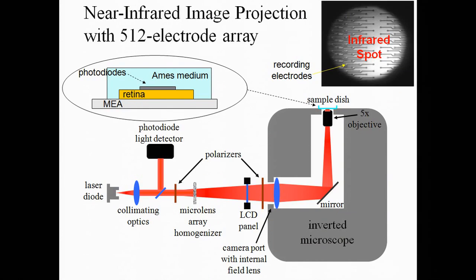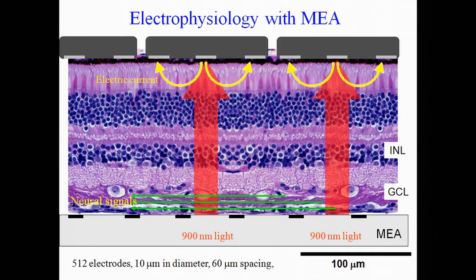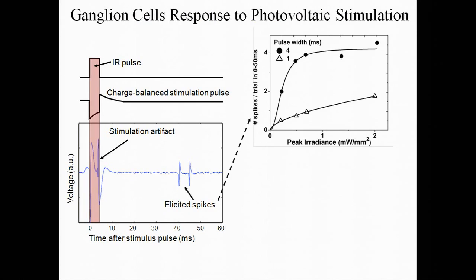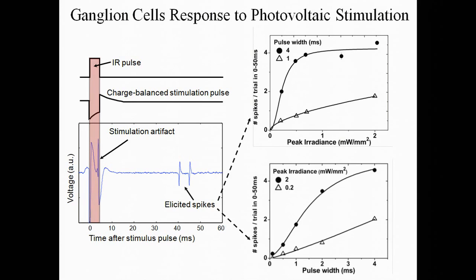To check what the retina does in response to stimulation, we use a multi-electrode array. It's an array of 500 little electrodes that read signals from hundreds of ganglion cells simultaneously. The image is projected onto a subretinal array through the retina, exactly like it happens in the eye. So the light goes through the retina, the photovoltaic array converts it into current, the cells are stimulated, signals are transmitted to ganglion cells, and we read them out with this multi-electrode array. What you see in response to a pulse of light is a current generated in each pixel. We pick it up as an artifact of stimulation, and then you see the retinal response, which is shown here in spikes. The number of spikes increases with brightness in each pixel, so we can modulate it like a normal LCD screen would. It also increases with duration, so we can control retinal output as in a DLP display, with the duration of the pulse in each pixel.